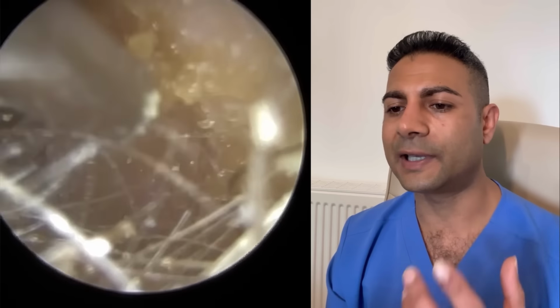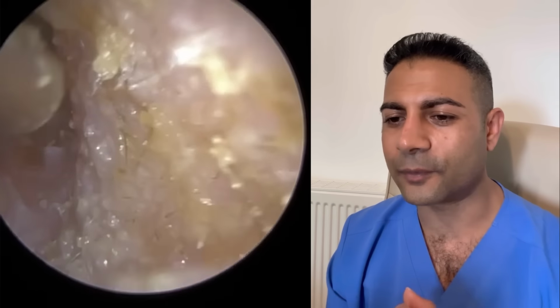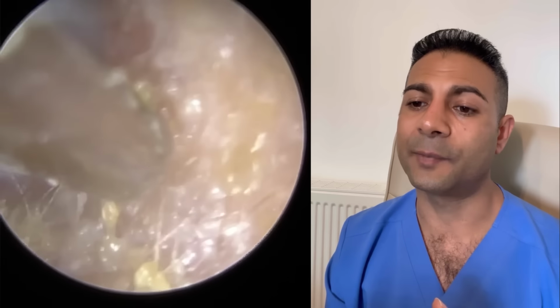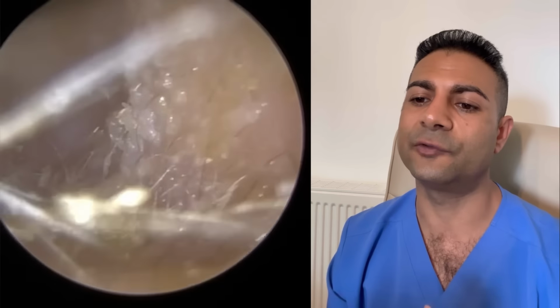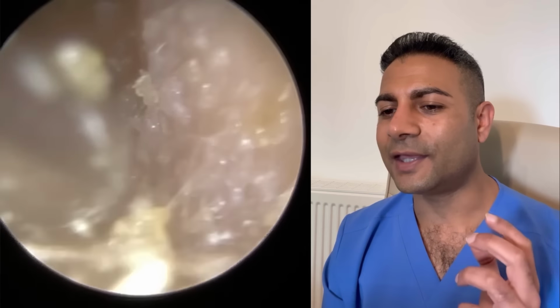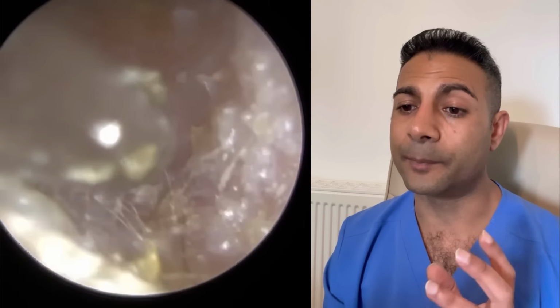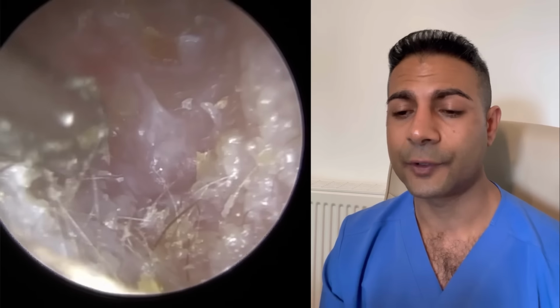So when we're working on the outer third of the ear canal, we can, I'm trying to phrase this right, not gung-ho, but we can apply a bit more pressure without it being sensitive to the patient. But if you do apply too much pressure, of course, it will be uncomfortable. When you enter the inner two thirds of the ear, that's what I call the danger zone. That's the bony part of the ear, and bone is a lot more rigid in comparison to cartilage.